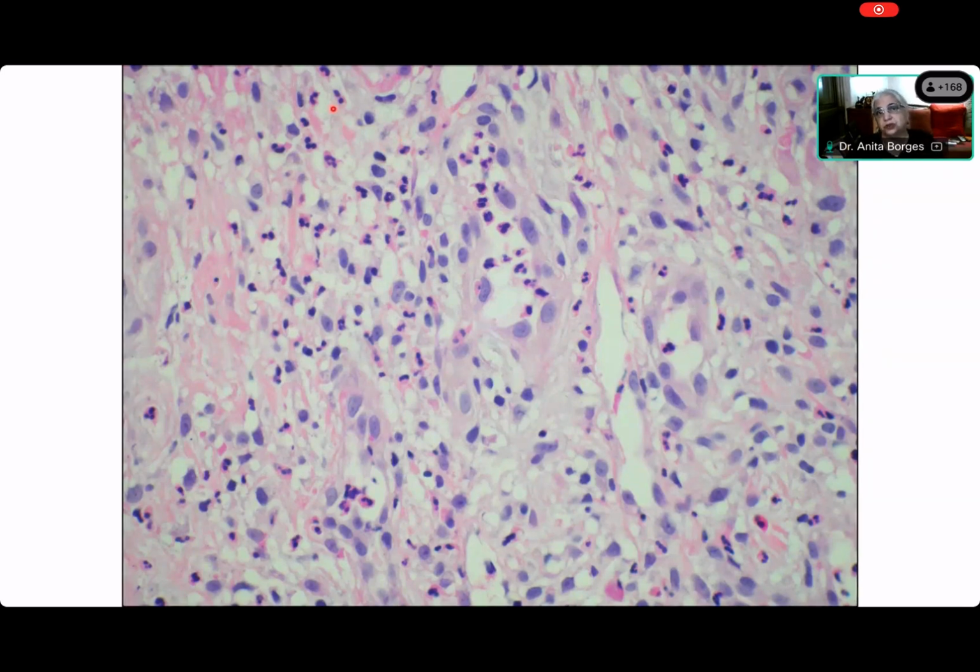So now, Kedar, you recognize that this is margination of leukocytes. Okay. Have you ever seen margination of leukocytes before, Kedar? No. It's there, but you have never noticed it. Okay. In every inflammatory condition, you will see margination of leukocytes, but nobody notices it. That's not the reason I put this up.